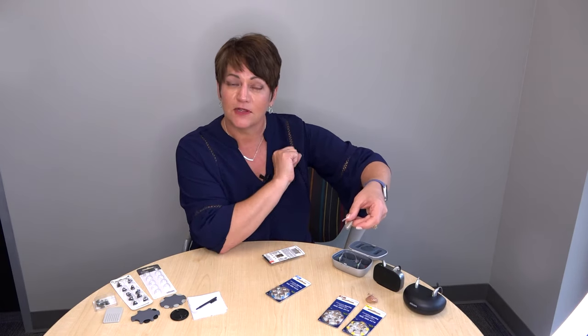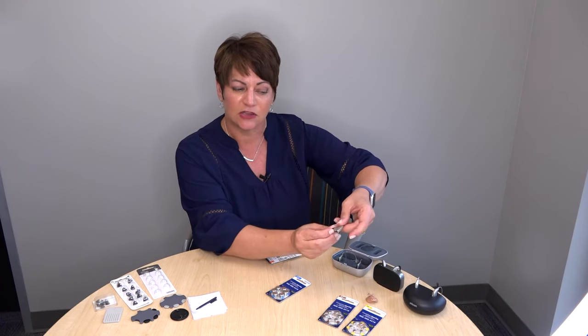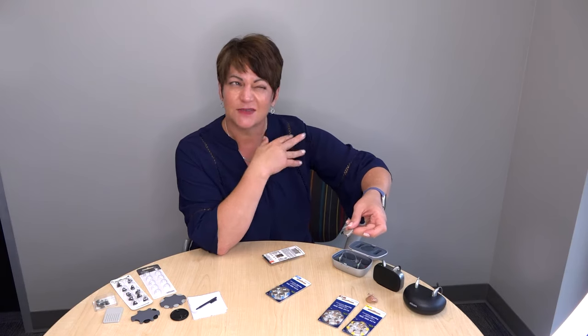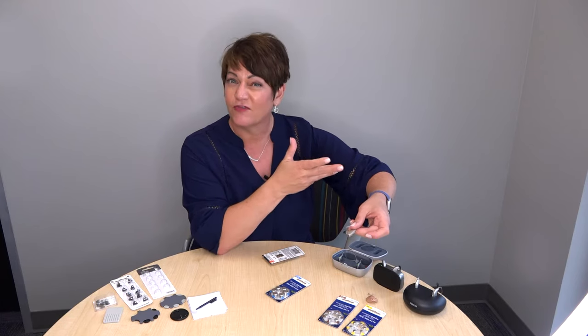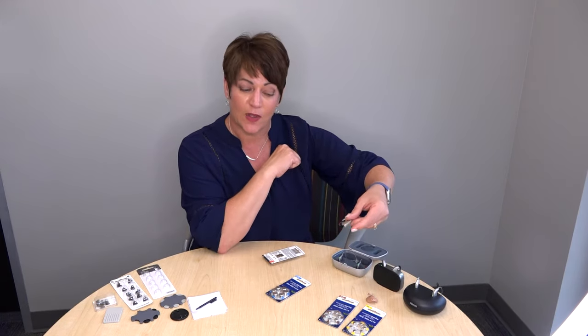The battery will power the hearing aid and it will power up. This is also how you turn your hearing aid on, and at night you simply open the door to turn it off. Most hearing aids have a dead battery indicator or low battery indicator that will tell you when the battery goes low. Your provider should have given you an idea of how long that will be.